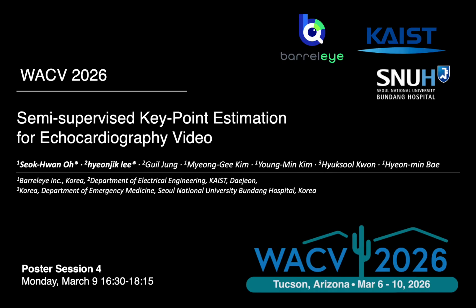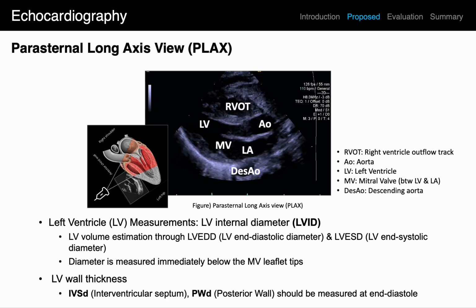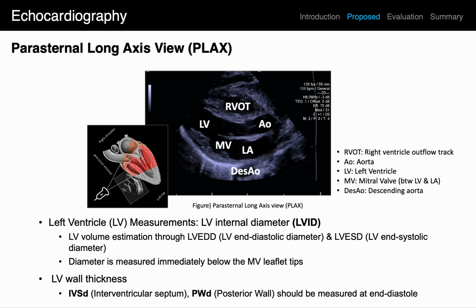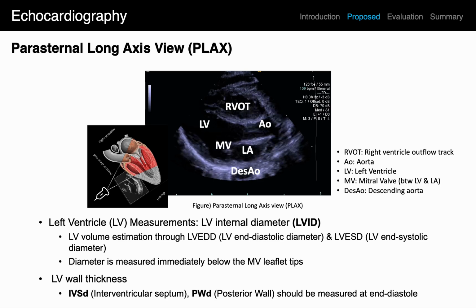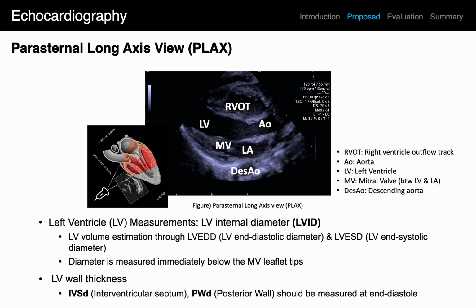Today I will present our work, Semi-supervised key point estimation for echocardiography video. Medical ultrasound, particularly echocardiography, plays a critical role in diagnosing and monitoring cardiac disease because it provides real-time imaging. Accurate assessment of left ventricular structure and function is essential for identifying conditions of the heart.